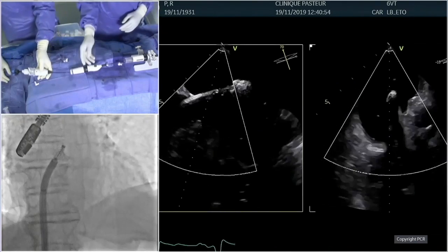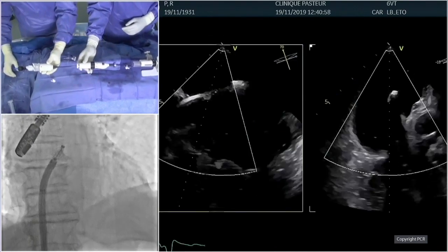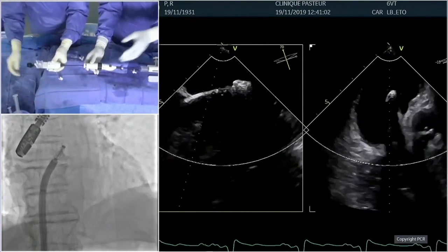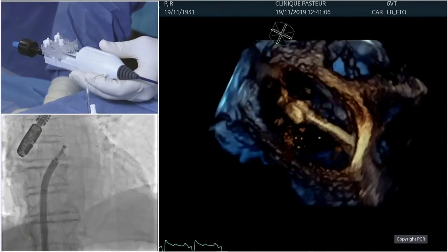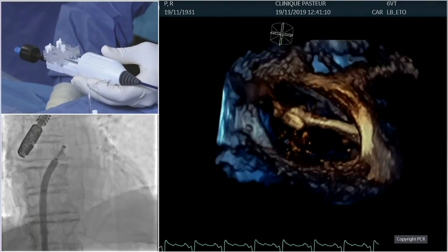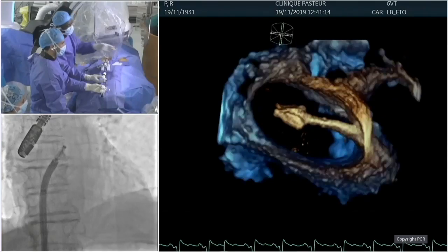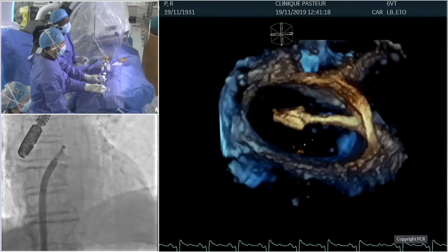So what we're going to do now, Nicolas, is to lift the paddles, the clasps. Lift the clasp just to make sure that afterwards we remove all the slack that is within the system. Because one beauty of this device is that the clasps are able to really follow the orientation of the paddle, so we can really not invert them, but really put them towards the apex of the left ventricle. So the freedom of movement is really impressive.